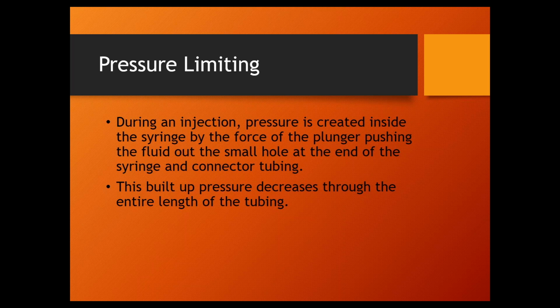If we're shooting a flow rate of 10 milliliters per second, it might only need to back off to like 9.5. We'll still probably get a good image. But if the system shuts off, we definitely won't get an image, so we definitely have to do it again. We might have to do it again anyway, but even if it hits its pressure limit, it doesn't mean it's a failure. We still might get good, useful images out of this procedure, and then we don't have to hit the patient again. Any questions? All righty.